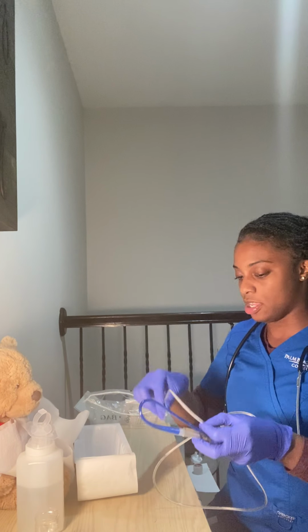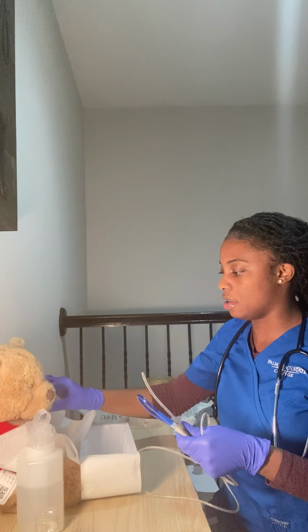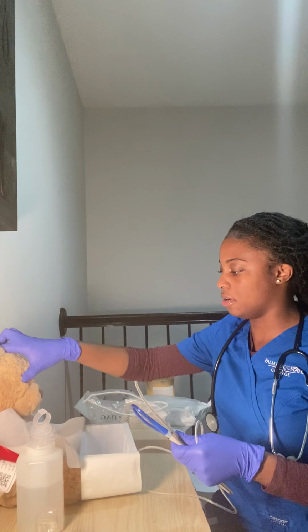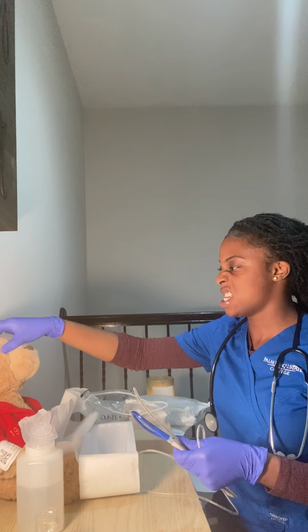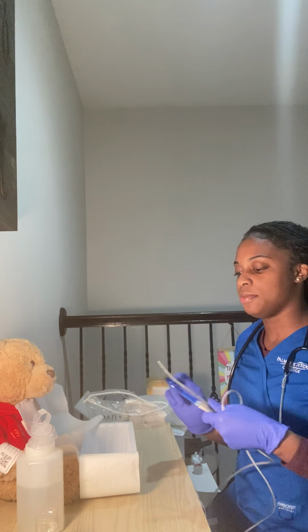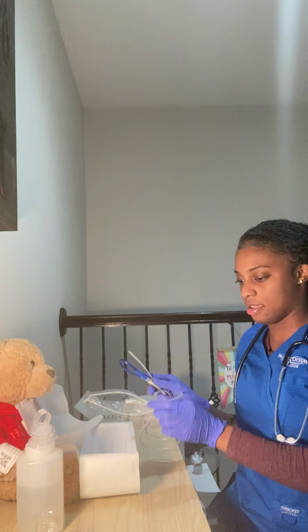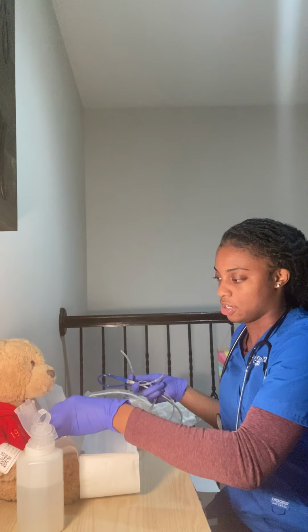Now that I've got that done, I'm gonna go ahead and lubricate my catheter. I'm gonna have my patient tilt their head up. They're sitting up, and we're gonna tilt our head up. Yeah, Mr. Teddy Bear. Okay. And we can go ahead and start. My patient's gonna have their water. I would have an assistant with me if possible, but my patient's 18 years old, so he's gonna be able to drink on his own.